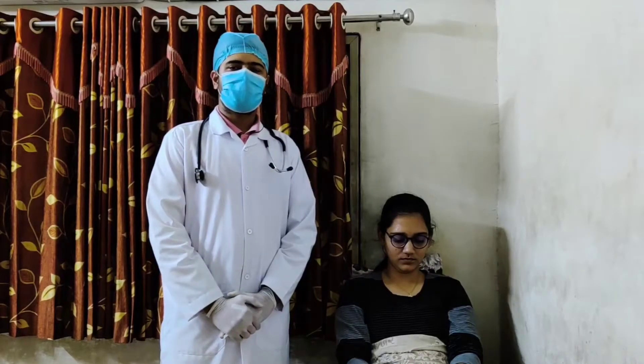Hello everyone. Today's topic is inserting a nasogastric tube. The patient is complaining of gastric immobility and bowel obstruction. A nasogastric tube is a flexible tube made of plastic which is inserted through the nostrils, via the esophagus, into the stomach.